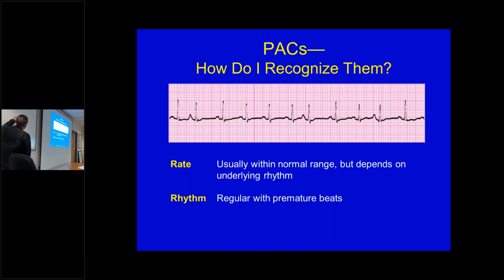That's why sometimes it can be flattened. And that would be if that excited tissue is like all the way down here. So you just don't see much of an impulse, right? That is probably from excited tissue that's all the way up at the top. So it's showing a different electrical impulse and a little bit higher and stronger one. Because you're getting a greater distance to that AV node, so you're having a stronger electrical impulse, and that's why the P wave looks beefier. Does that make sense? So then you could have a flat looking P wave if it was lower in the atrium.